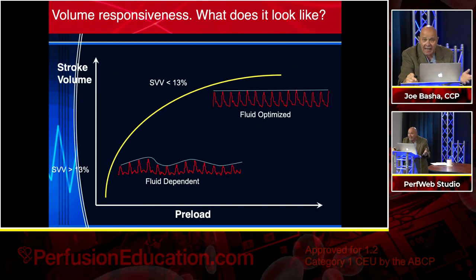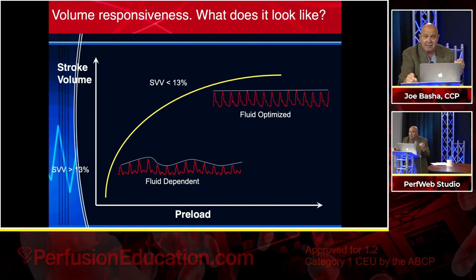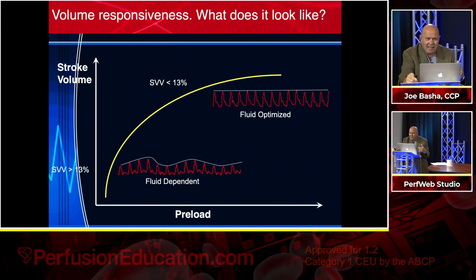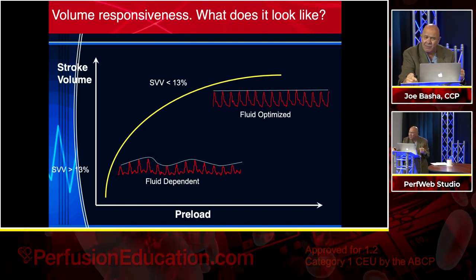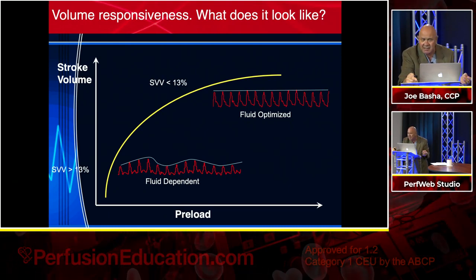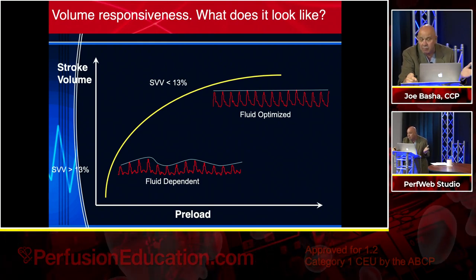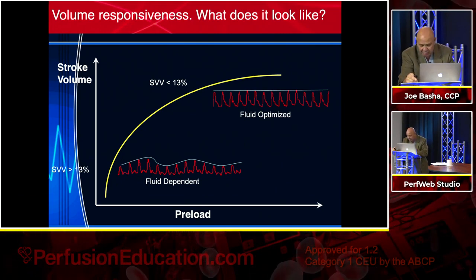And that is classic for hypovolemia. But now you actually have a number, because if you just look at that, you may recognize it, may not. As it becomes less subtle, but still more than 13%, you may not be able to distinguish that, because even if you look up at the top, you can see there is some variation. But would you call that more or less than 13%? I don't know. I think it's better to have an actual number that you can measure.